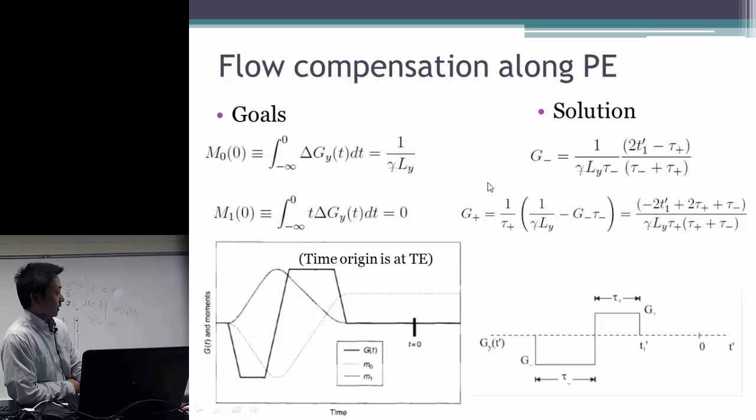Given the FOV, the resolution, and a given total duration, we can calculate the amplitude for these two gradient lobes.